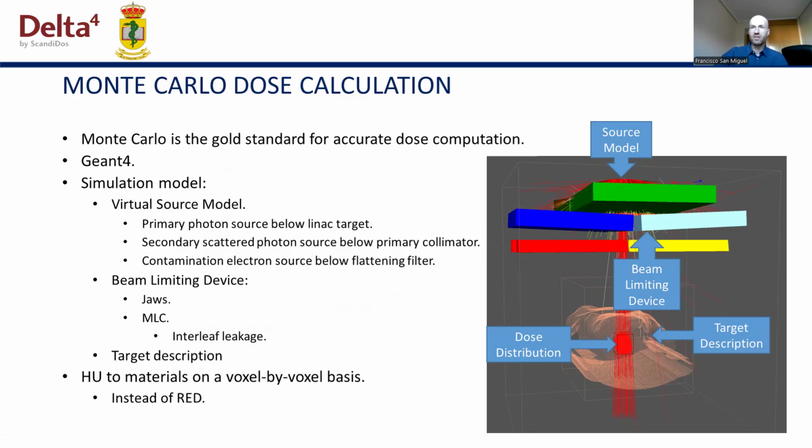Then, Insight directly simulates the particle interactions in the beam limiting devices in the beam line by instantiating the three-dimensional geometry of the physical objects, which include jaws and MLC leaves.